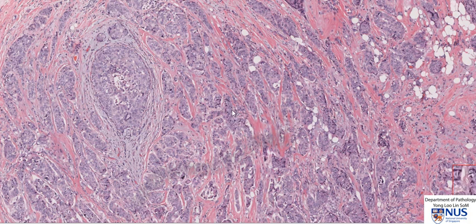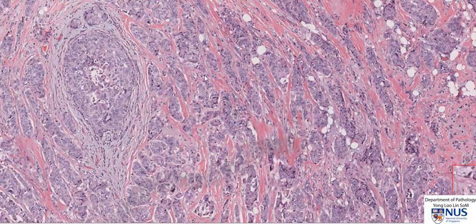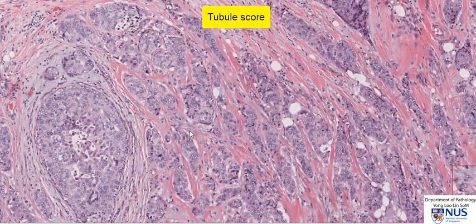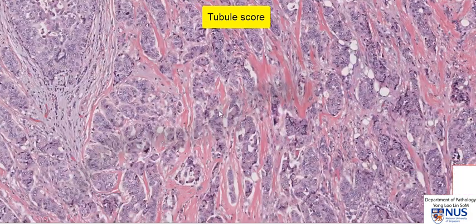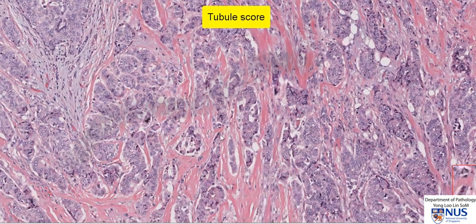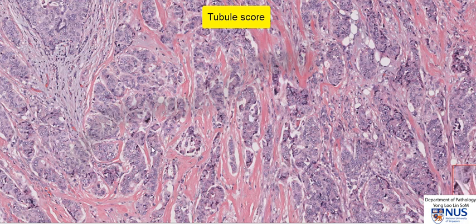Let's look at the tubule score first. There is actually some tubule formation — we can see small lumina in some of the cell nests. At the same time, there are some more solid-looking areas. So there's a combination of tubule-forming areas as well as more solid nests, which gives this a tubule score of 2.